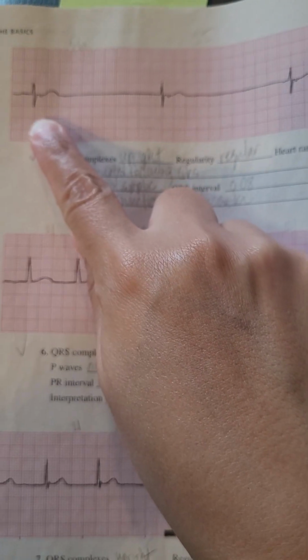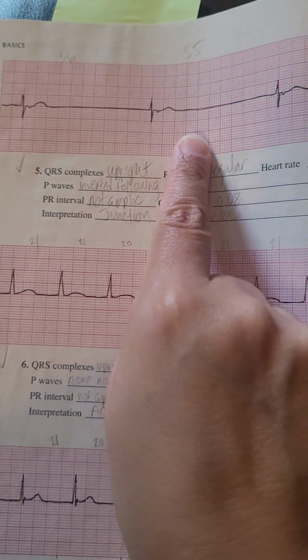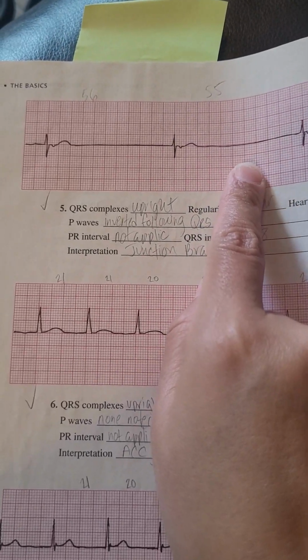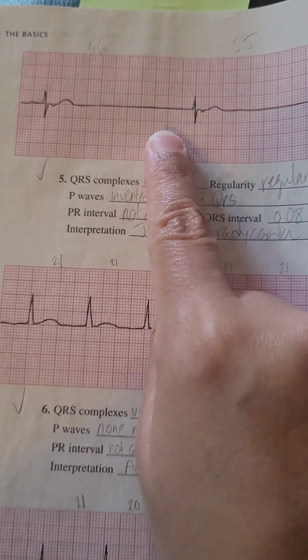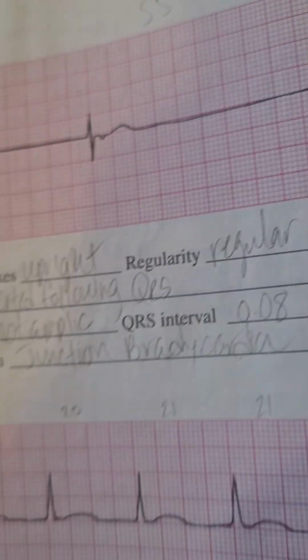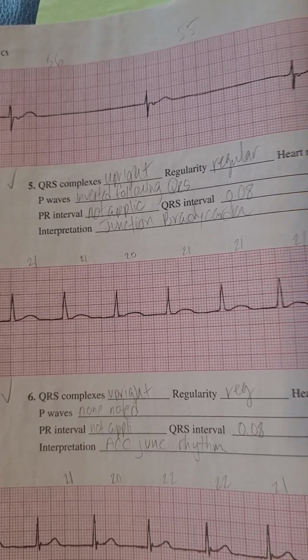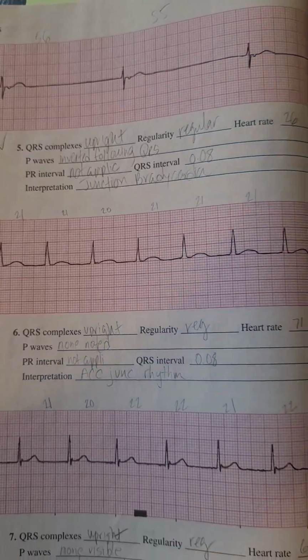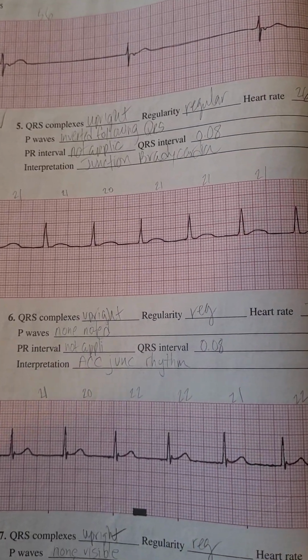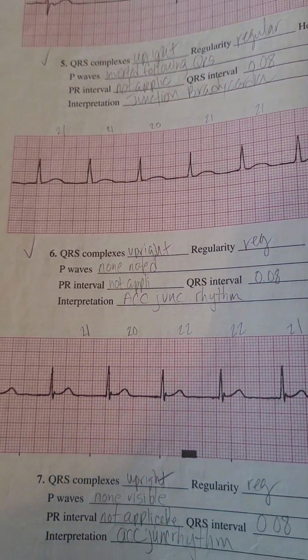What is this one? 1, 2, 3. For the most part, I guess it's marching out. It's a junctional rhythm. So what is that? Junctional Brady, or junctional bradycardia. Heart rate is 30 beats per minute. 1, 2, 3. Add a 0, 30.